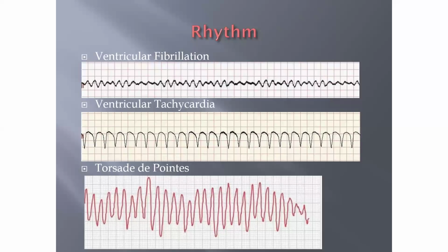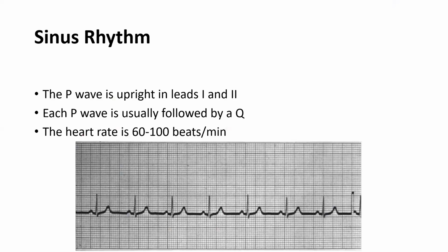This tachycardia also can be pulseless ventricular tachycardia. It can be polymorphic ventricular tachycardia, otherwise known as torsade de pointes. When the last two rhythms do not have a pulse, this patient will require to be defibrillated. Same as ventricular fibrillation, they become lethal rhythms. When they have a pulse, ventricular tachycardia and torsade de pointes, then you need to treat the patient to get to know what the issues are, so that you reduce the rhythm, and probably give the drug that is going to cause the rhythm to convert, basically known as cardioversion. Good.